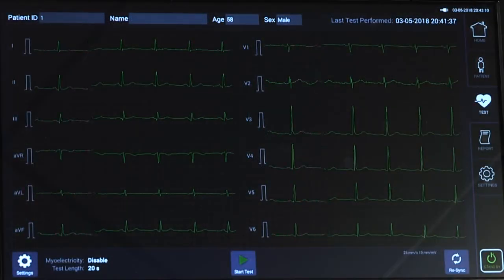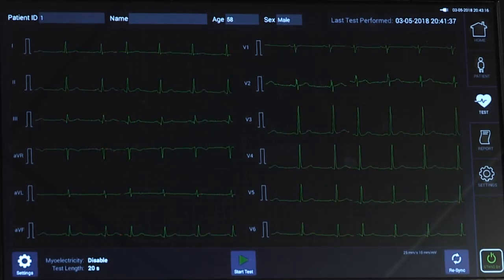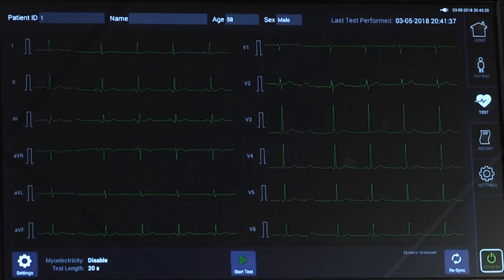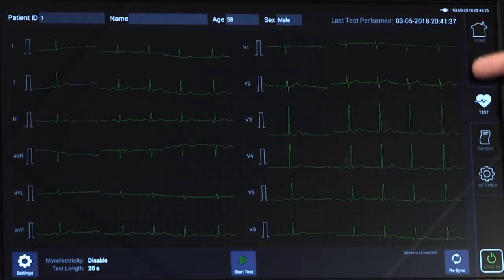After the patient is connected to all cables, waveforms will start to appear on the testing screen of the device. Be sure to check the quality of the waveforms before running a test. Troubleshoot any noise artifacts, baseline wander, or lead-off indicators as needed.